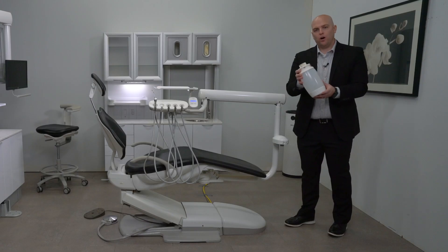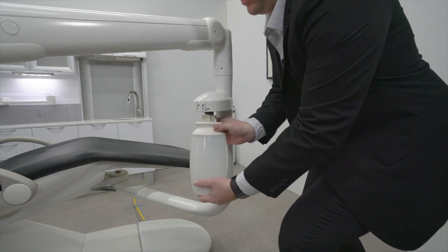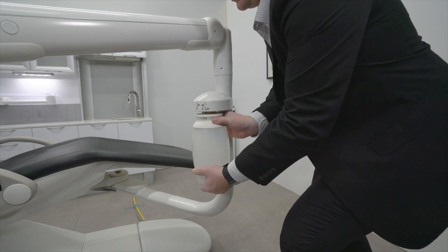To reinstall the water bottle, simply attach and tighten clockwise.